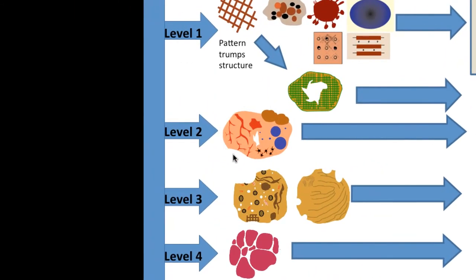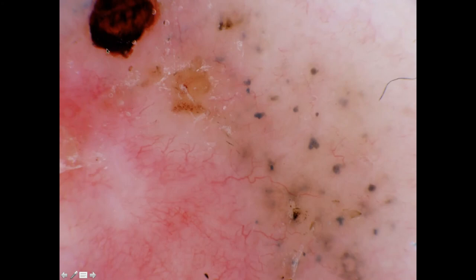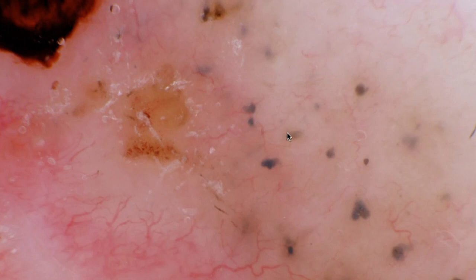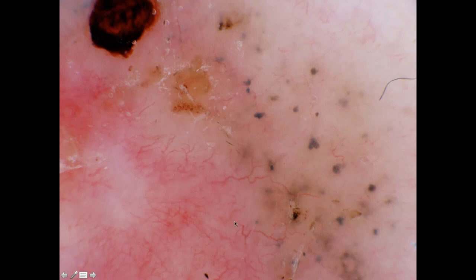At level two we look for criteria of basal cell carcinoma: arborizing telangiectasia, ulceration, leaf-like areas at the periphery, multiple blue-gray ovoid nests, multiple blue-gray dots and globules, crystalline or chrysalis structures, shiny white lines, and spoke-wheel structures. Looking at the slides, we find ulceration, blood crust, yellow serum crust, multiple blue-gray dots and globules, a beginning spoke-wheel structure, arborizing telangiectasia, and some leaf-like areas.